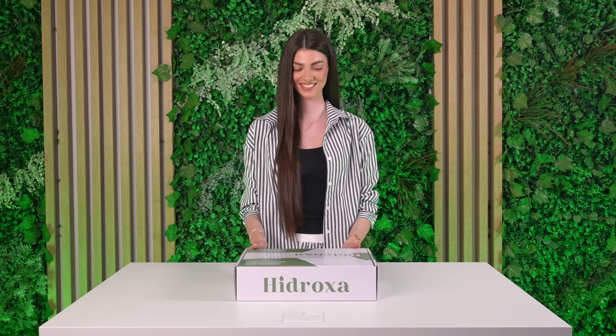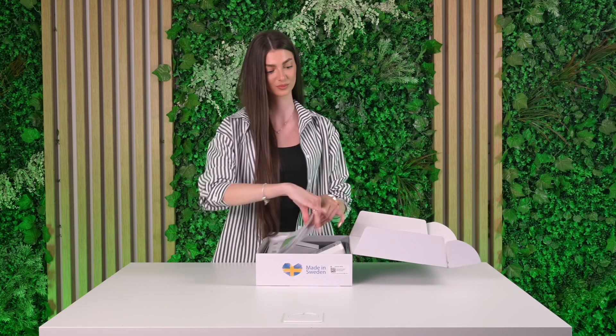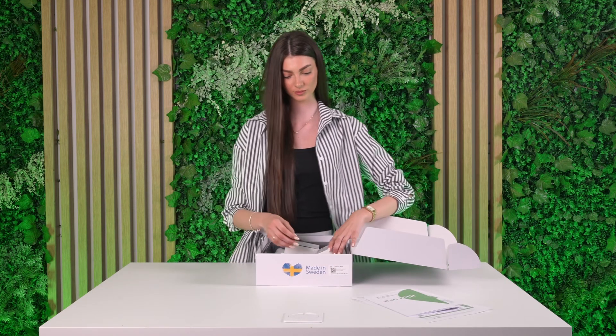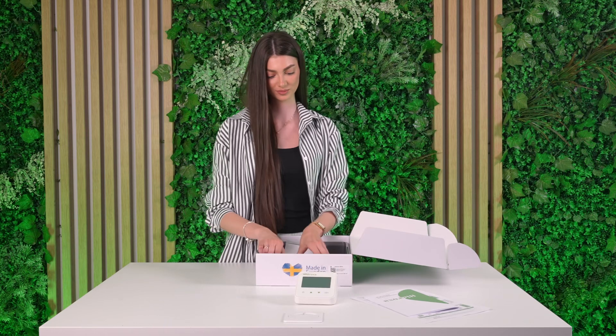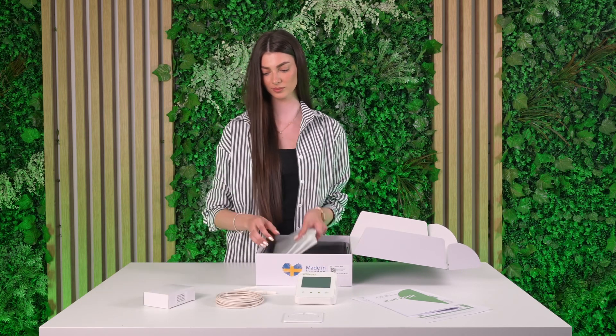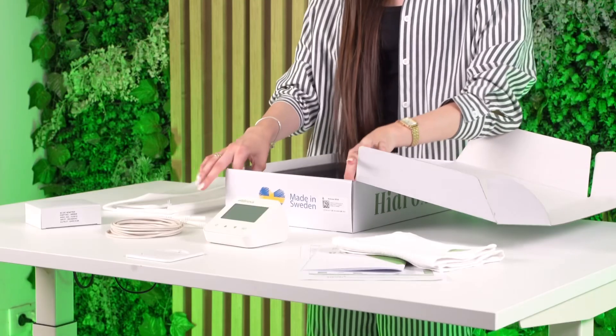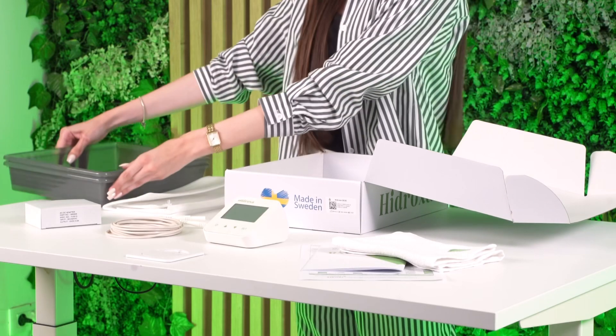Hello and welcome. In this video, we'll show you how to use the Hydroxa SE30, a home-use medical device designed to treat excessive sweating of the hands, feet, and underarms. You'll learn how to set it up, perform treatment safely, and care for your skin and the device. Let's begin.